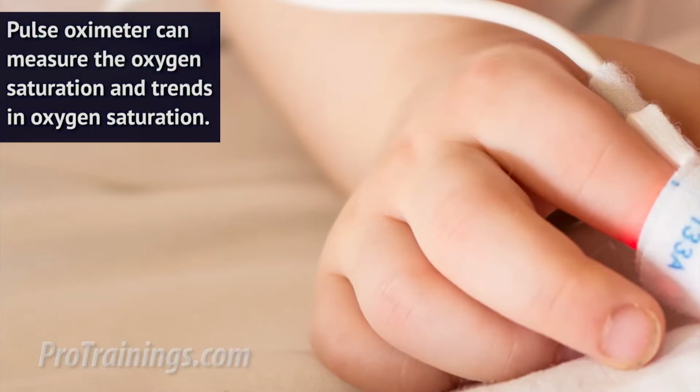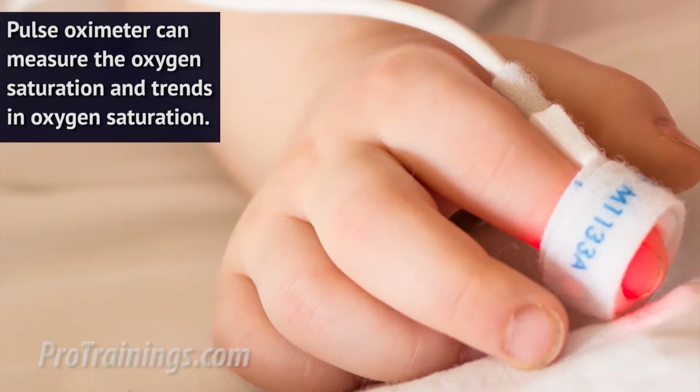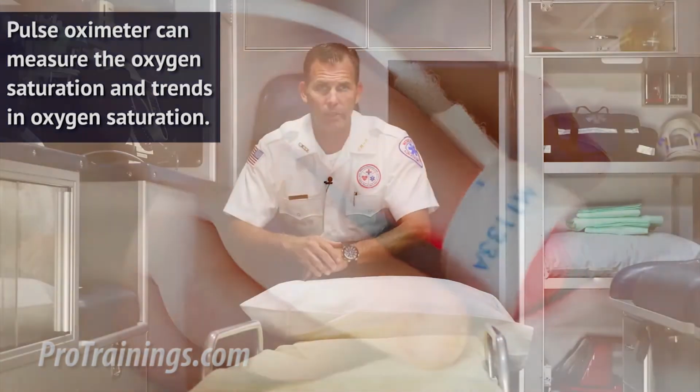Now, there are a few very helpful external tools used for monitoring the oxygenation of a patient. One of the most popular and most frequently used is the pulse oximeter. It can be a measurement tool that measures oxygen saturation and trends in that oxygen saturation. The way that the pulse oximeter works is that it measures the percentage of hemoglobin that is fully saturated or bound with oxygen molecules. It's very important to remember that oxygen saturation does not equate to oxygen delivery to the tissues, and the pulse ox doesn't provide information about the effectiveness of the ventilation or the elimination of carbon dioxide.